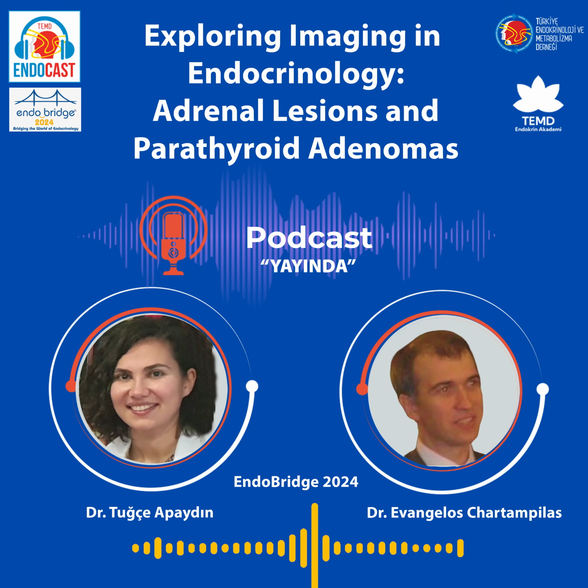So you usually find a nodule, let's say a 2-centimeter nodule, on the left or right adrenal. If it's on the unenhanced CT and it's less than 10 Hounsfield units, then you're sure it's an adenoma and you can leave it alone. Okay, so 10 Hounsfield units is the cutoff to tell it's an adenoma. If it's between 10 and 30 Hounsfield units, then it may still be an adenoma. You could perform an MRI with a chemical shift imaging sequence and detect intracytoplasmic lipid. If there's a signal drop on the opposed-phase compared to the in-phase image, then again, you're sure it's an adenoma and you leave it alone.